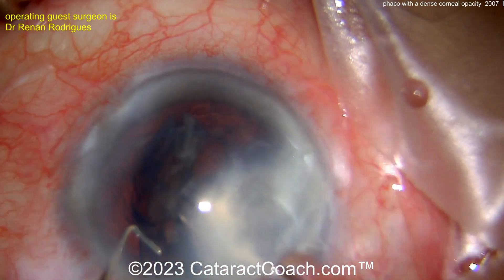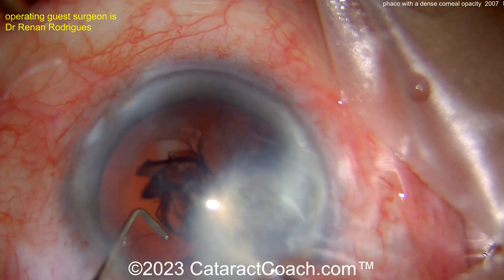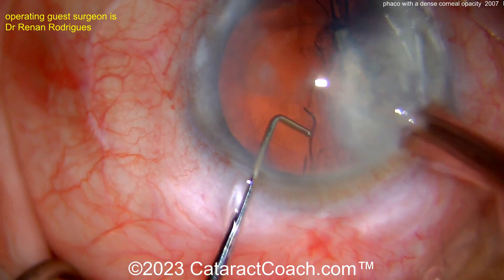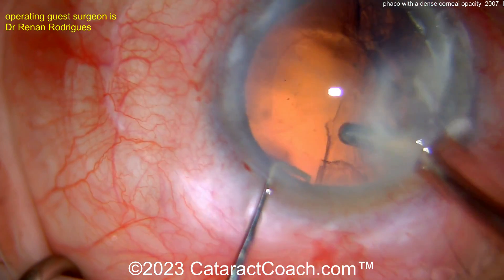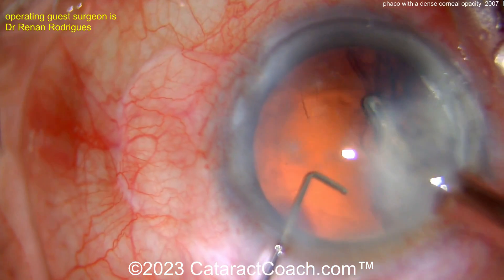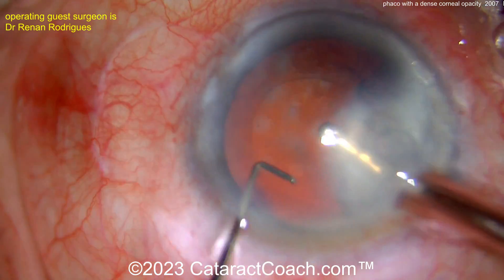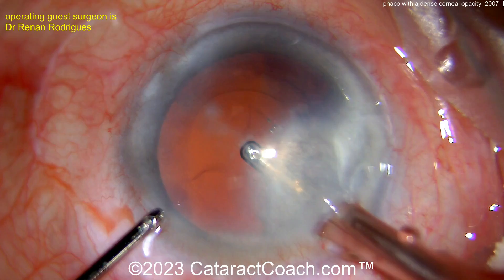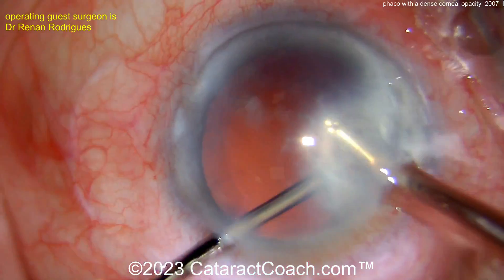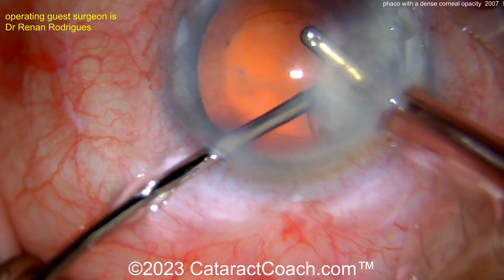You'd much rather this patient end up minus one post-operatively instead of plus one — that makes sense. Which formula should you use? You need to use a formula where you enter an anterior chamber depth. If you use an old formula like Hoffer Q, Holladay 1, or SRK/T, those formulas use keratometry and axial length alone to guess the anterior chamber depth and effective lens position. But that corneal scar could cause a lot of flattening — corneal power may be 37 or 38 diopters, much lower than expected. So use a formula that you input the AC depth: Ladas Super Formula at iovcalc.com, Barrett, Haigis, or Holladay 2. All these formulas require anterior chamber depth in addition to keratometry and axial length, so you can be a lot more accurate.